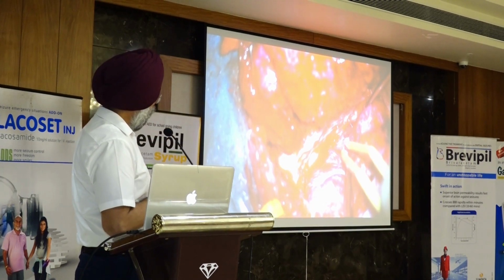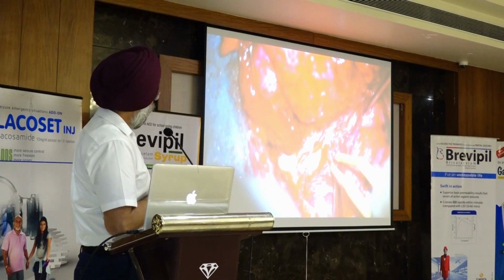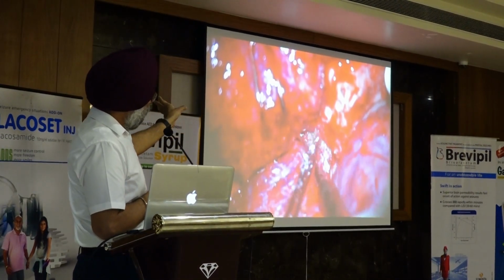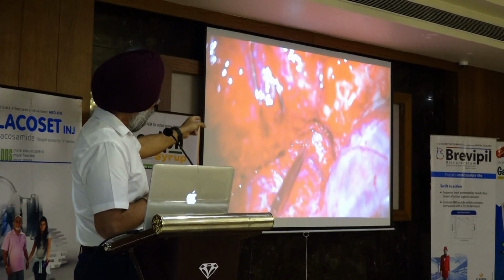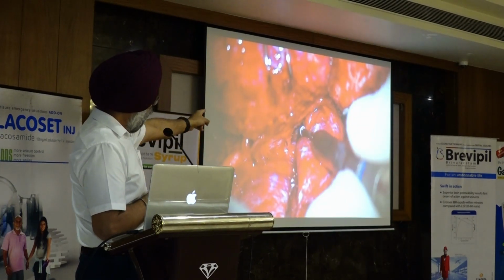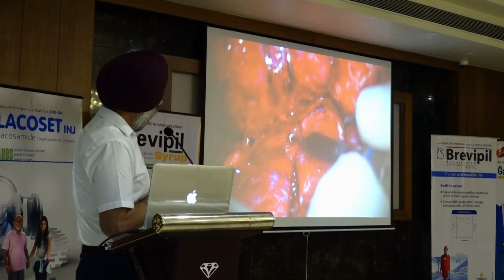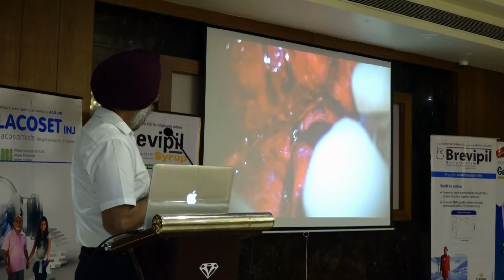So this is the coagulation of a few of the bleeders, and the middle meningeal artery needs to be first dissected and cut. This is the drilling of the superior orbital fissure, so that this will expose a little bit of your orbital area, the periorbita, and orbitozygomatic osteotomy is not required. This is the V2 division, on the right side of the drill. And this is the drilling over the V3 so that it is clearly in line.